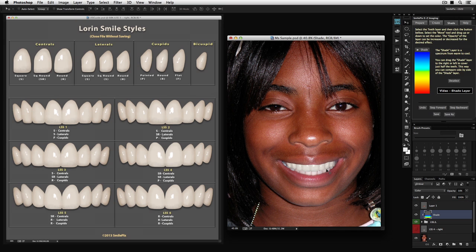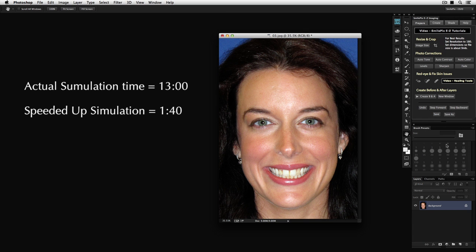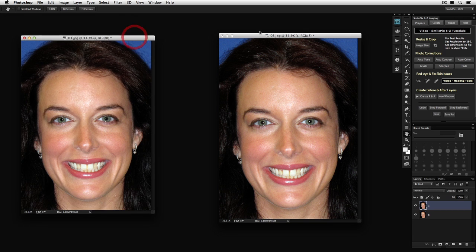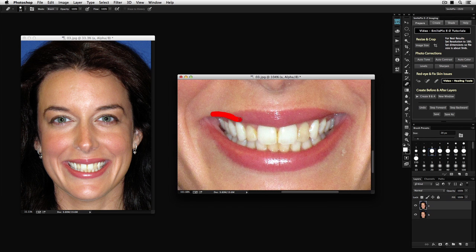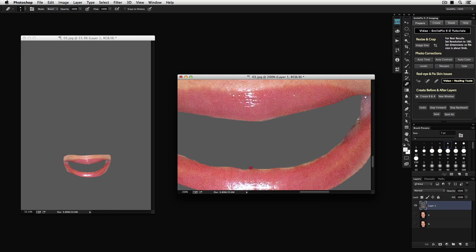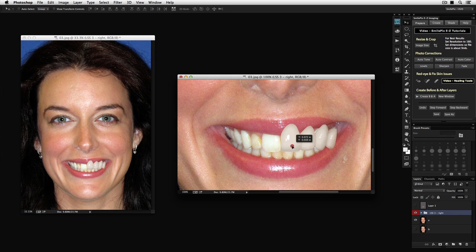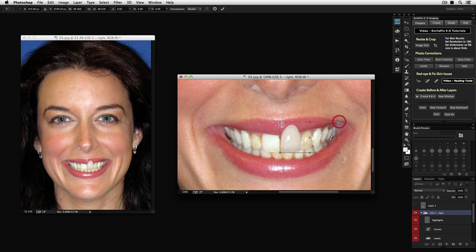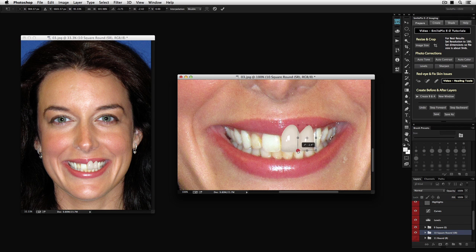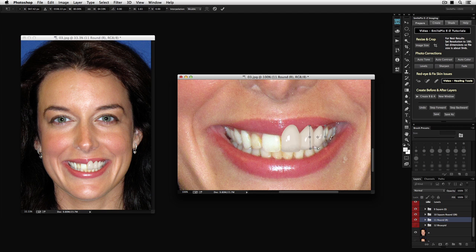This simulation has additional adjustments, such as placing individual teeth in the proper position and correcting the shade. To see the whole smile simulation, watch this next part, which is a speeded up version of the whole smile simulation process.